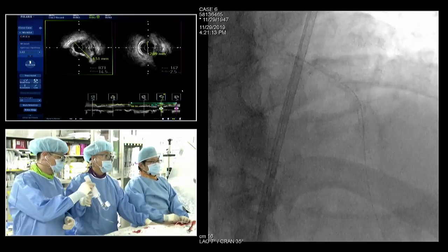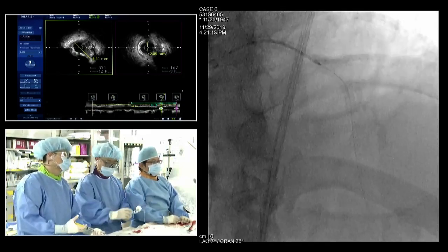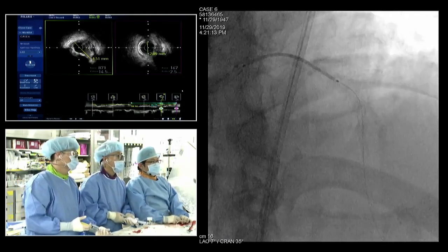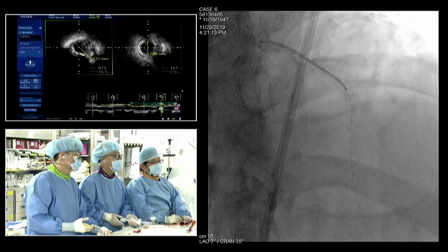Side branches, right? Calcific lesion, that's getting more complex. Okay, this is Anatomy 38. It is simplification of the anatomy. Okay, good.